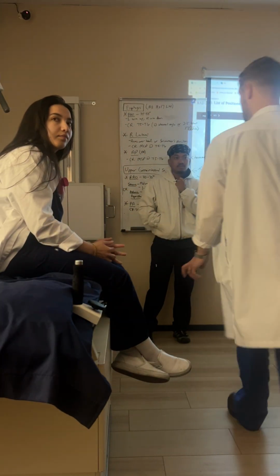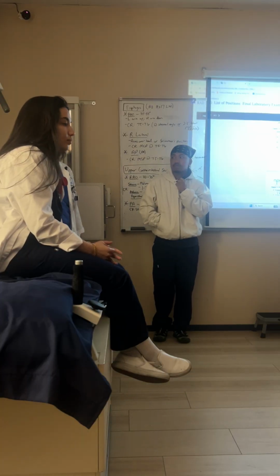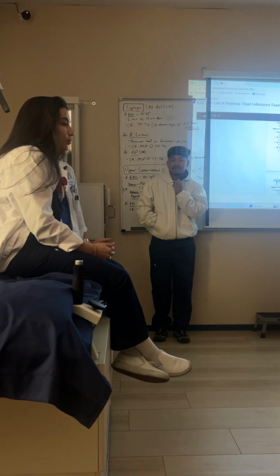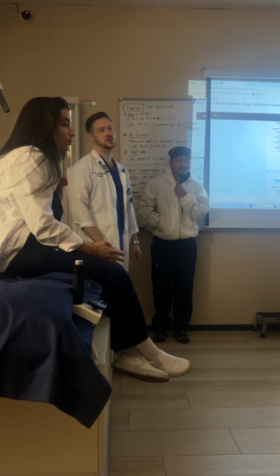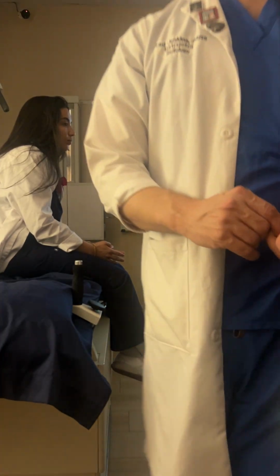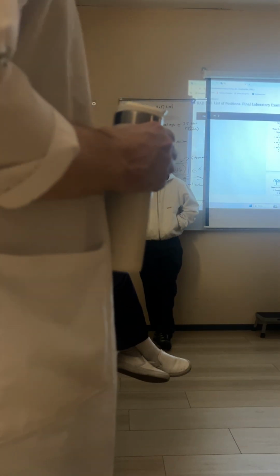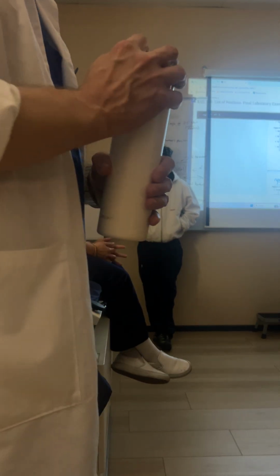You're going to be very, very aware during a BE, because if their feet get caught up in that, no bueno. Especially if the balloon is inflated. Questions? I don't know if that's a warning or like a trauma. A little bit of column A, a little bit of column B. I will get you guys a better outline for a script, so you guys can use that, okay?